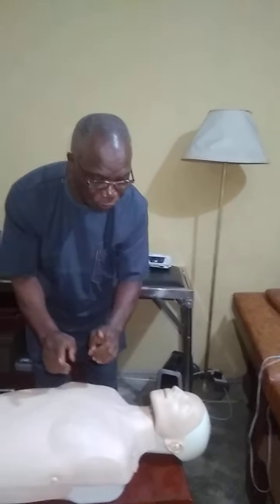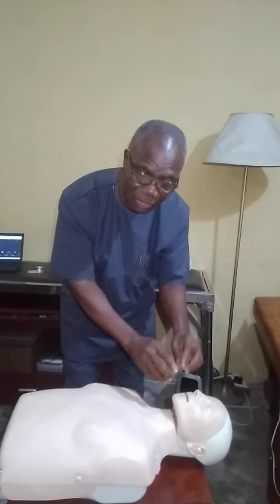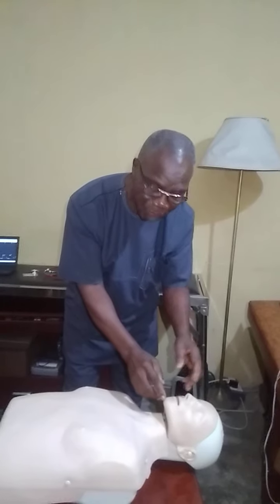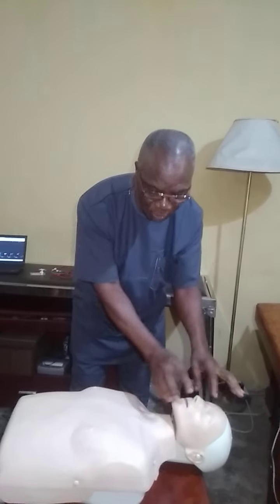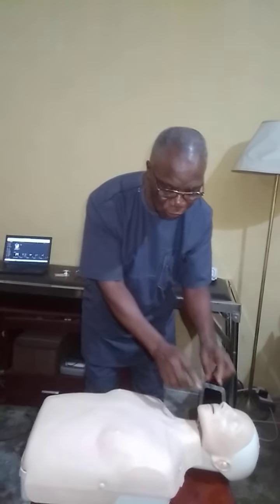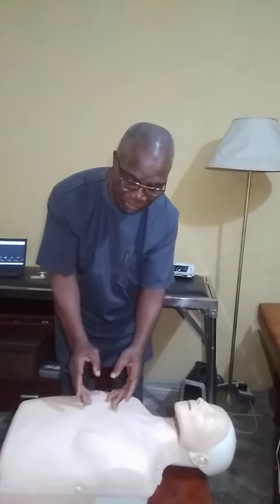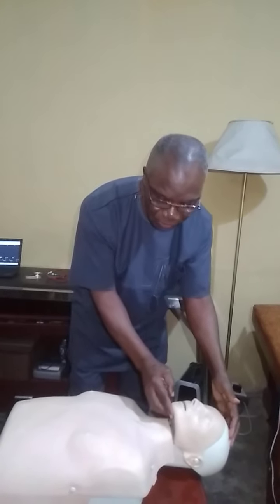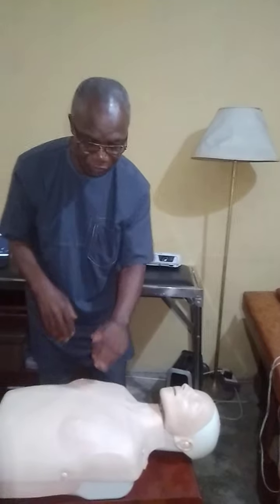And when you do the breath, you check whether the chest rose. If the chest did not, you tilt the head or adjust the head properly. So I'm going to just demonstrate that, and I will do exactly what I just talked about now.